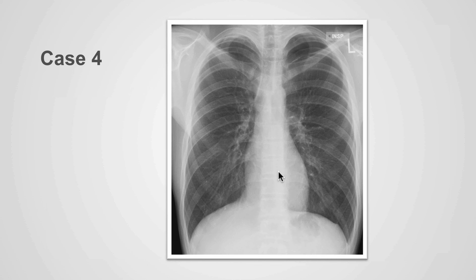Can you identify the pneumothorax on this examination? Please pause the video and try. In this case, we can identify the clear line of the visceral pleura in the left apex and the paucity of markings and increased blackness within the left apex, consistent with a left apical pneumothorax.